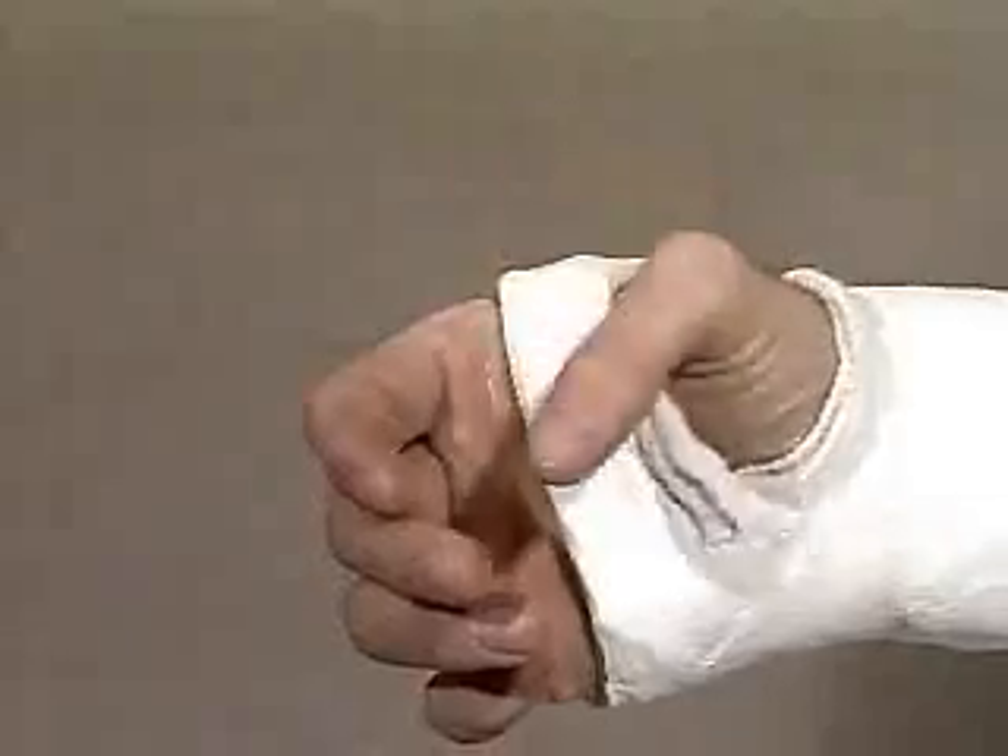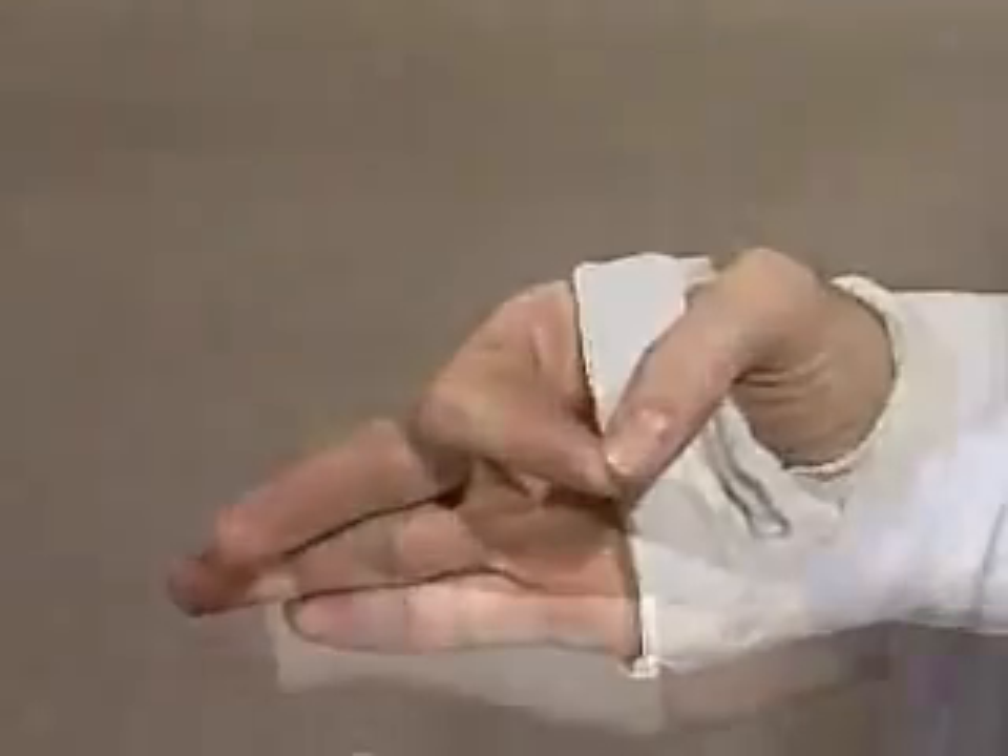Check to ensure the thumb and MCPs are free to move and elbow flexion is unhindered.